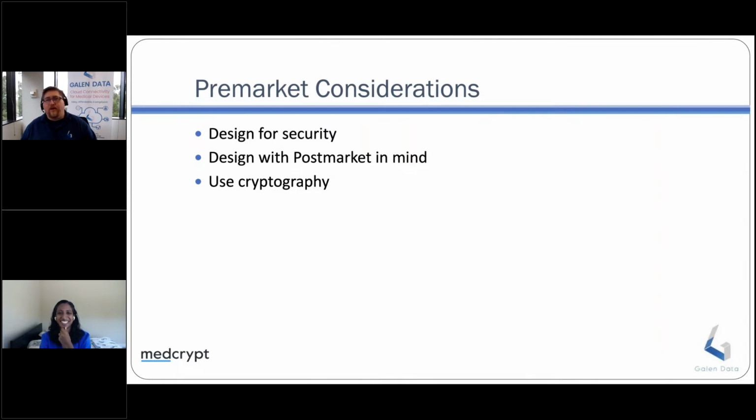You get into a lot of regulatory issues. With the FDA, it's become very apparent that this is, as Vidya said earlier, the latest draft guidance that was issued in April is 50 pages long, and it's extremely extensive. If you're not doing those things from the beginning, you're going to fall behind very quickly and get a lot of pushback.